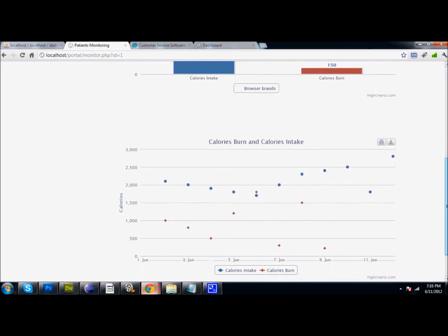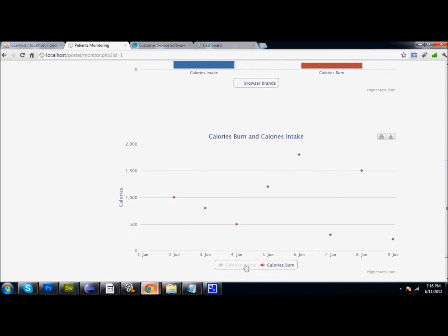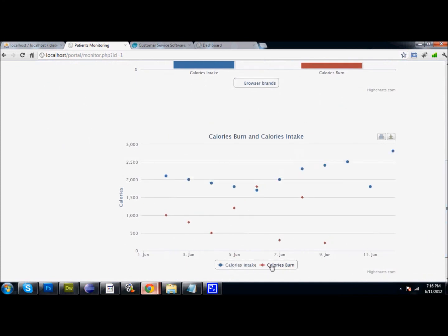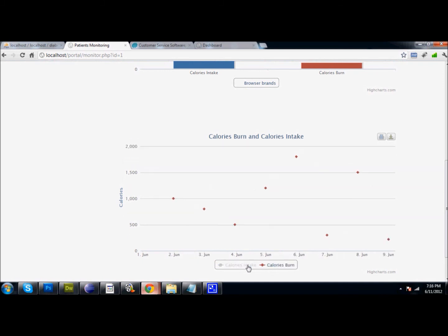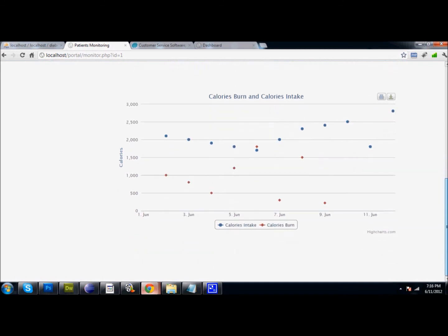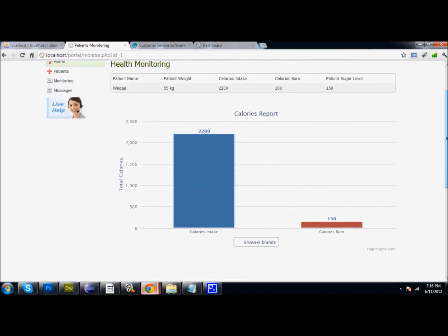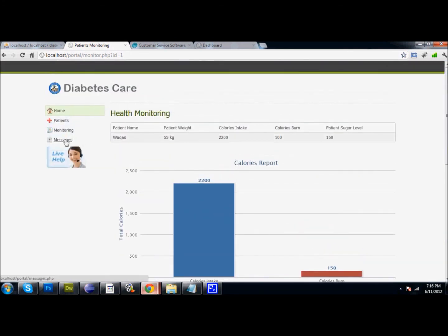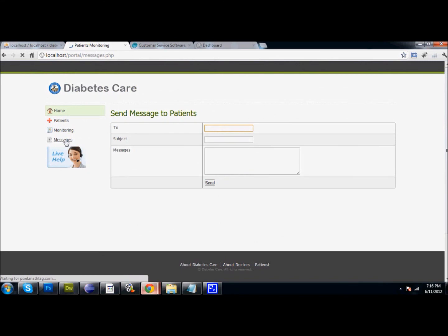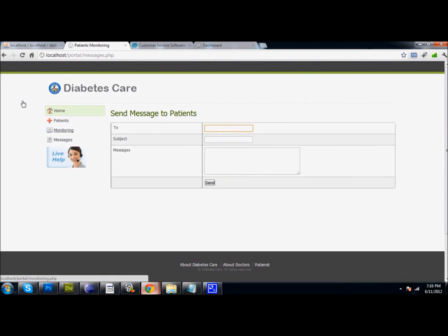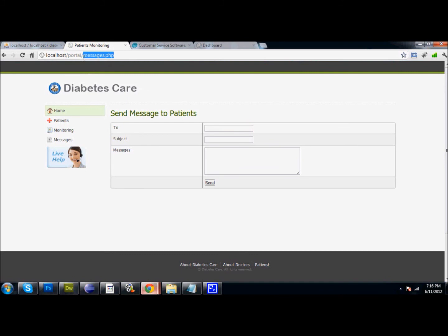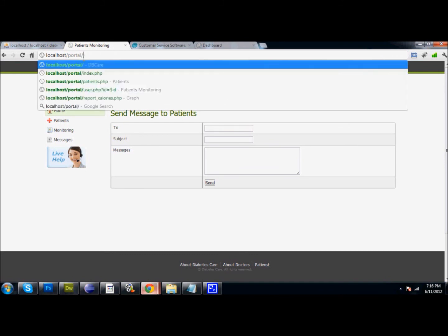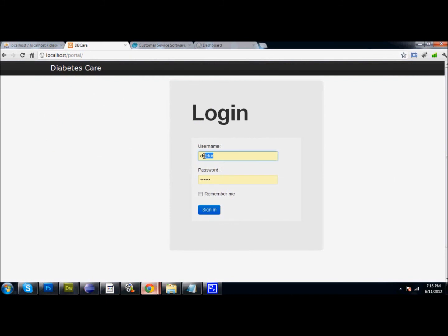The blue dots show calorie intake and the red dots show calories burned. The doctor can view both or remove either one from the graph dynamically. He can also send messages to any particular patient and chat with them live so that patients can ask about real issues.